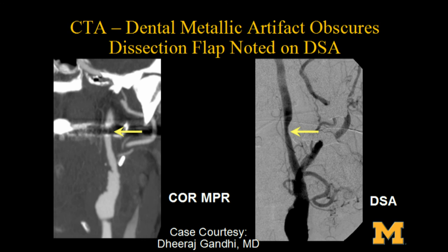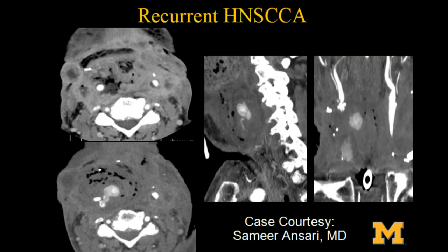So the last case I'll show is this. Now, I'm a head and neck guy, right? So I cannot give a lecture without talking about head and neck cancer, because I love head and neck cancer. So this patient came in, and we're going to spend the next 2 hours going over all of these post-treatment changes, right? No, we're not. Obviously, this patient had a variety of complex treatments: chemotherapy, radiation therapy, bilateral neck dissections. He had a total laryngectomy. He had a pull through.